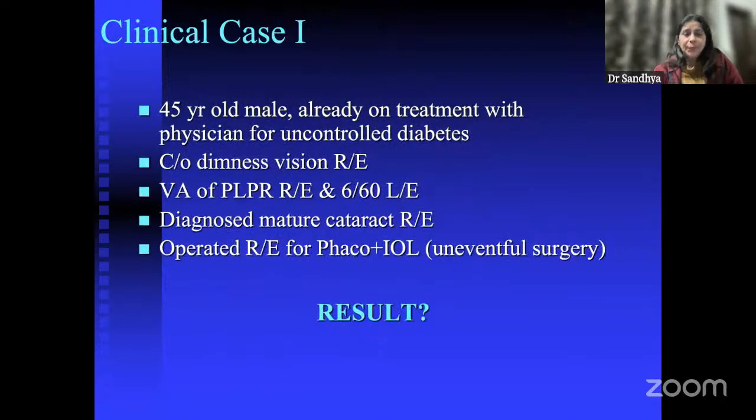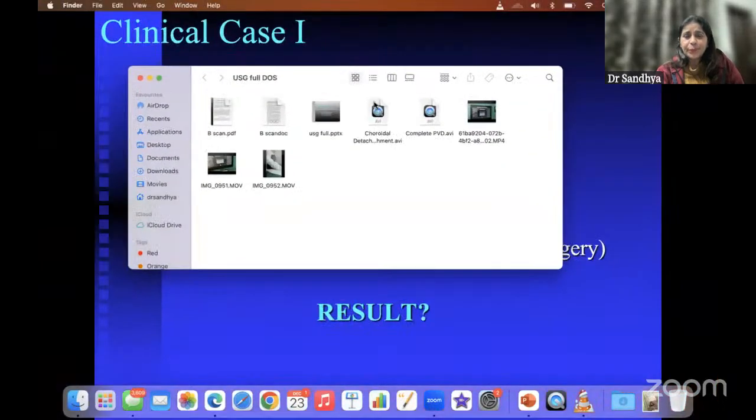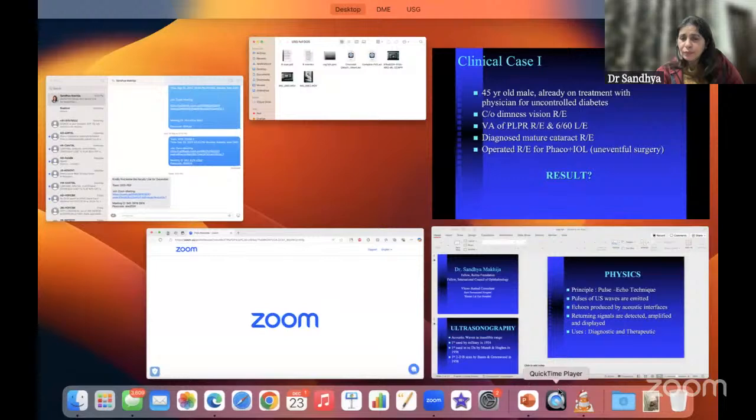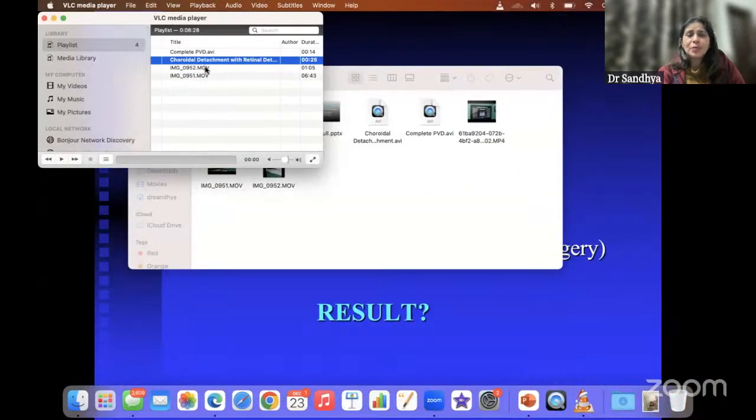So I will be taking a few clinical cases, but I thought I'll show you some videos also. Okay, before clinical cases, I think we'll go on with some videos.